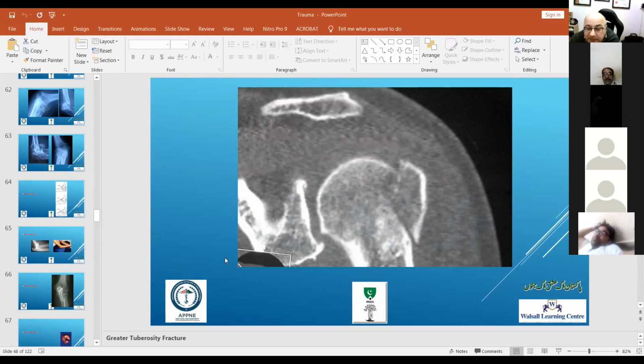Yeah, so the strongest part of this bone is the supraspinatus tendon. So you have to fix these by putting a stitch through the supraspinatus tendon, okay? And do what is called a figure of 8 or a tension banding of it. So it goes through the supraspinatus, and you can then make a hole in the humerus and go through it, or you can put a screw here and put the figure of 8 around it.